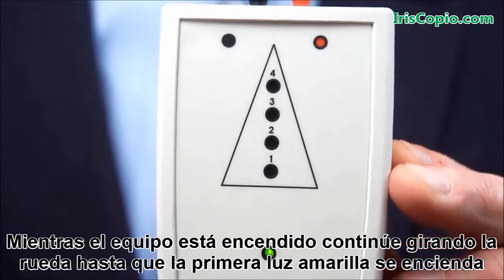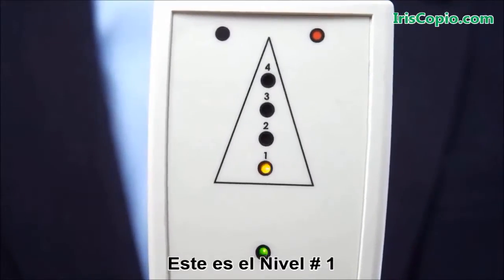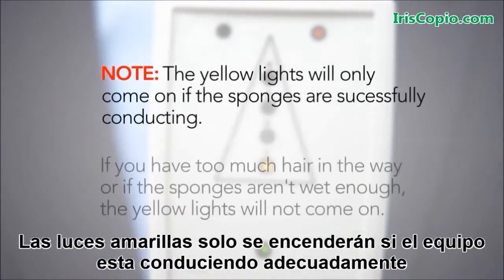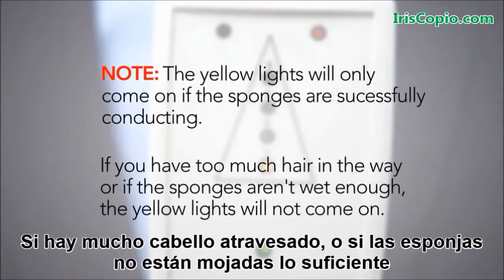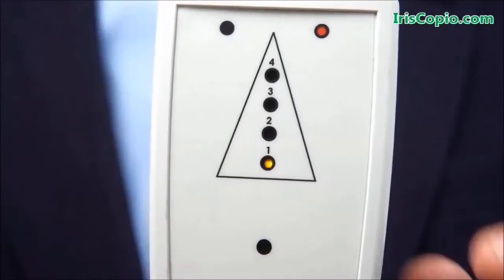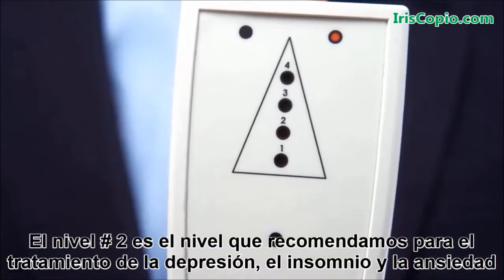Once the device is on, continue to turn the wheel until you see the first yellow light come on — this is yellow light number one. The yellow lights will only come on if the device is successfully conducting. If you have too much hair in the way, or if the sponges are not wet enough, the yellow lights will not come on. Yellow light number two is the setting we recommend starting with to treat depression, insomnia, and anxiety.